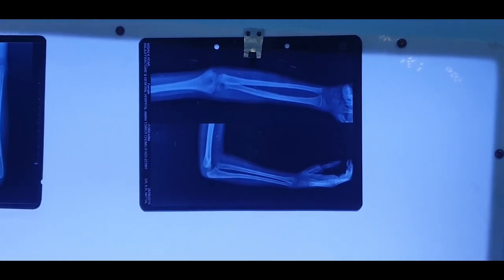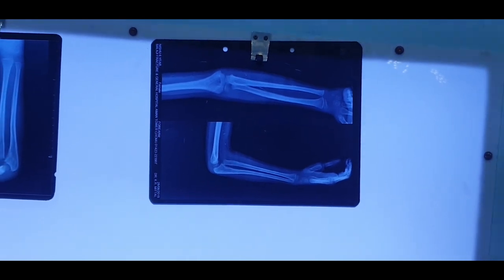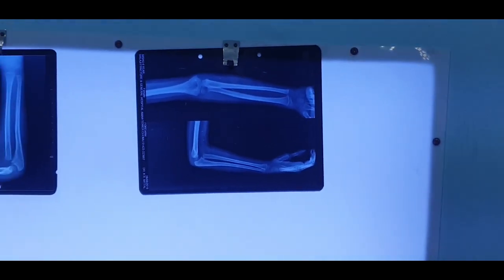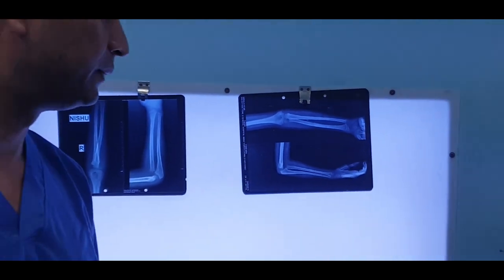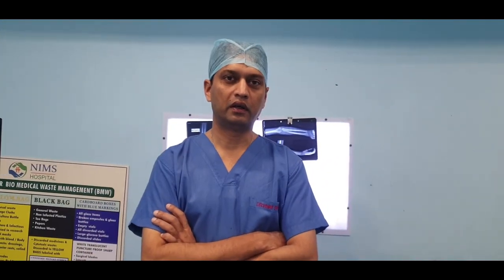If she had come to me initially, I would have tried to manipulate it, gain ulna length, and put her into a plaster. However, she is now 3 weeks down the line. My plan is to do an ulna osteotomy, increase the length of the ulna, and hopefully that will reduce the radial head. However, as it is 3 weeks down the line, there is a good chance this may not reduce and we may have to perform an open reduction.